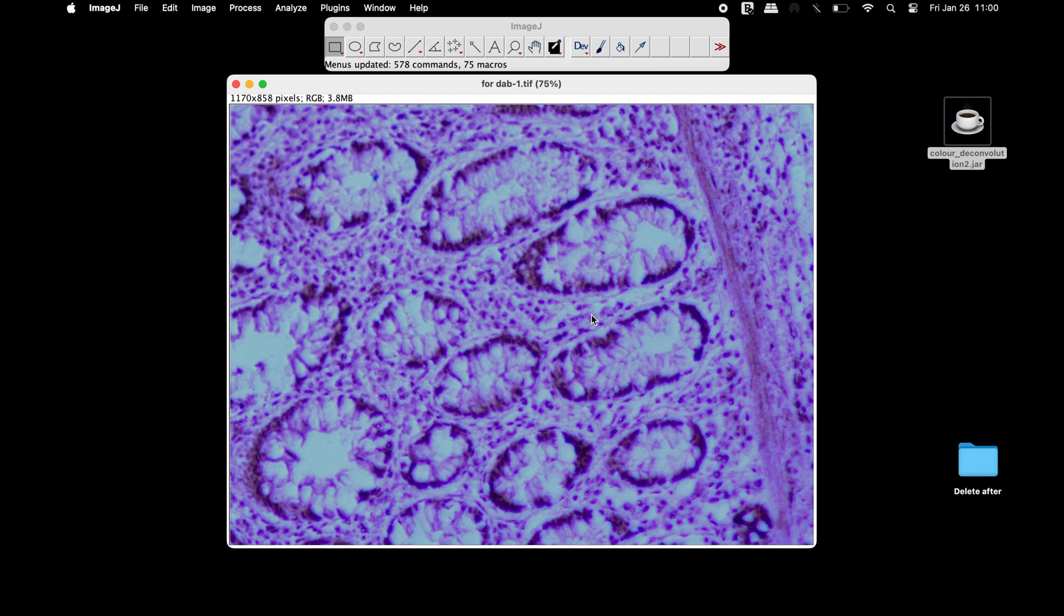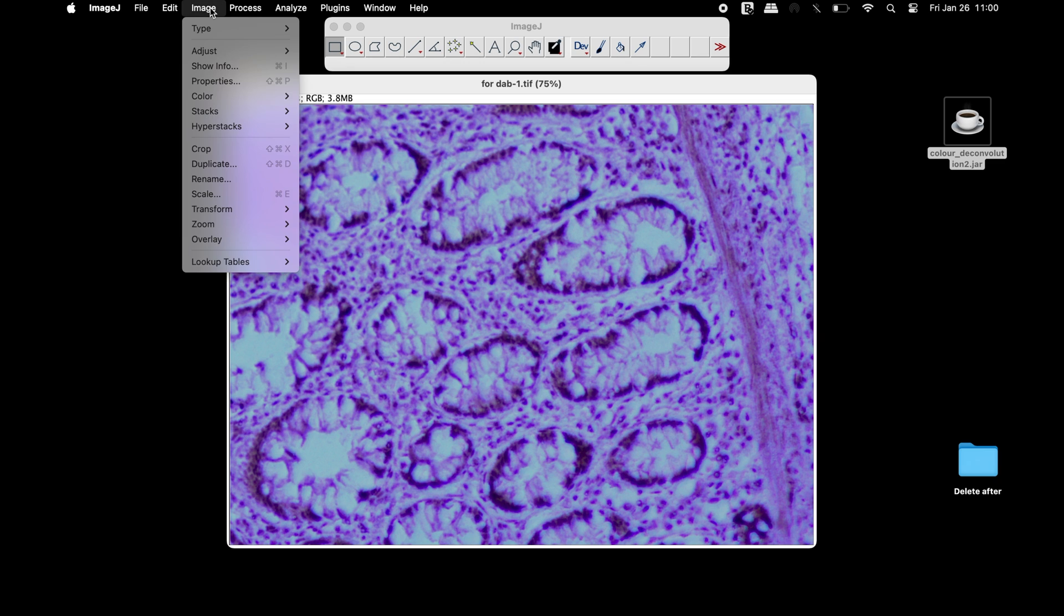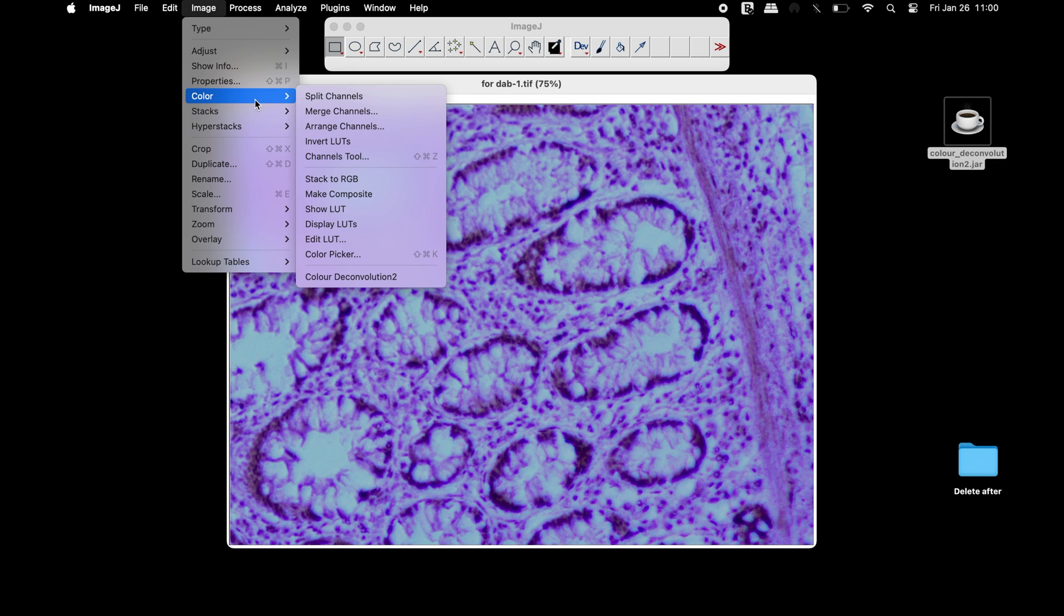Now, head to Image, Color, and select the plugin Color Deconvolution 2.